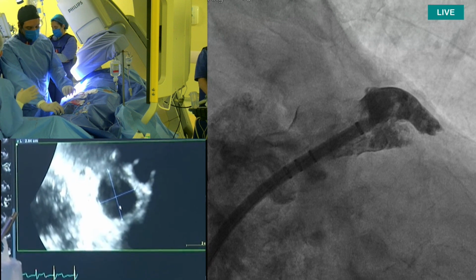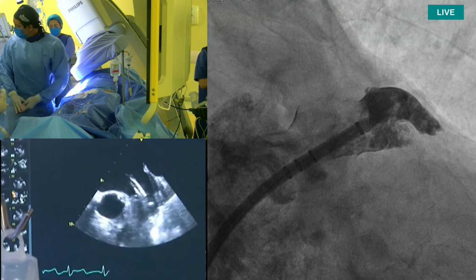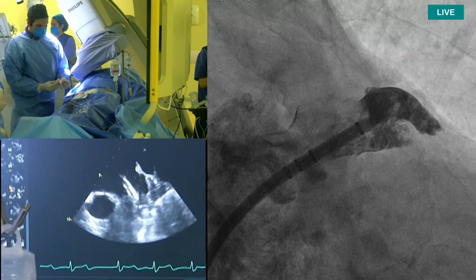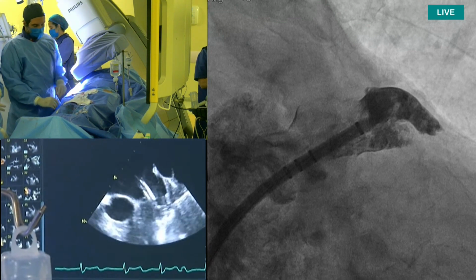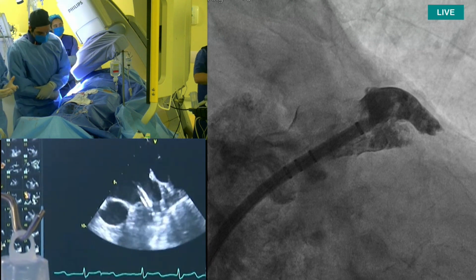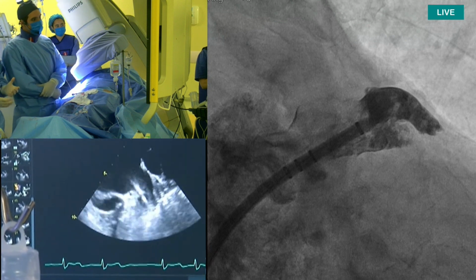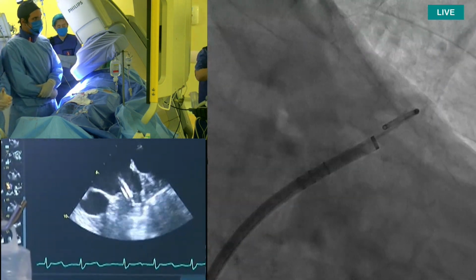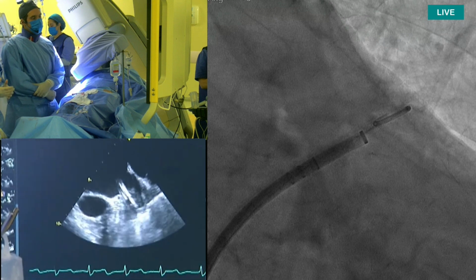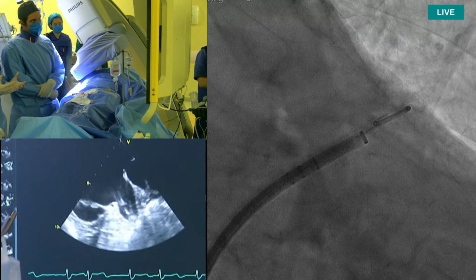Dr. Oli, do you change your strategy during the procedure if you see different measurements in TE or ICE? What do you do in your practice? Yeah, it depends on which device you're working with. Now we're working with the Watchman Flex. We know the Watchman Flex is a very conformable device, so it's more forgiving for oversizing. If you are in a gray zone, a borderline zone, based on your CT measurements or your TE measurements, you may doubt between two sizes. But if on fluoroscopy you see that you have really good depth, then you're maybe better to go for the larger device, because it's a very conformable device.